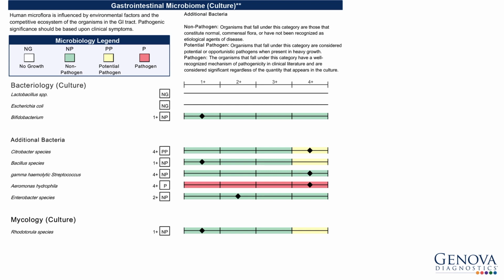Bacterial culture complements the PCR assessment to provide a more complete survey of a patient's gut microbiota. The thing to note here is that we see Lactobacillus and Bifidobacterium low in both PCR and culture, again supporting the need for probiotics. It is not uncommon for patients to have a few additional bacteria.